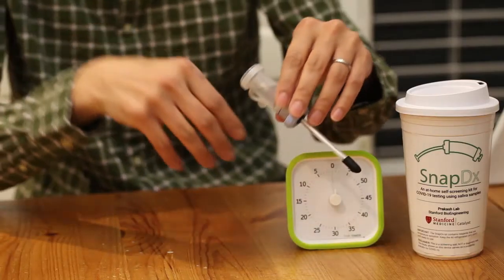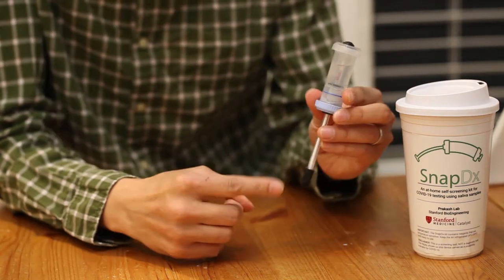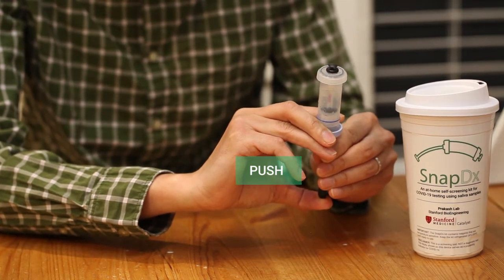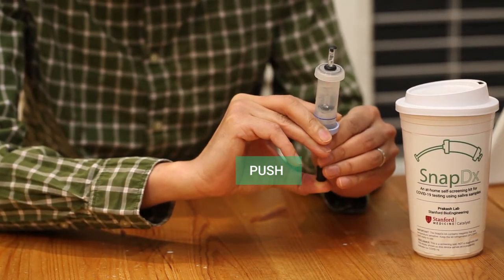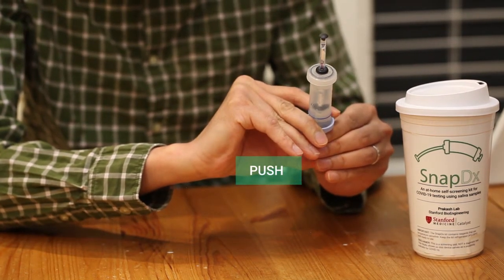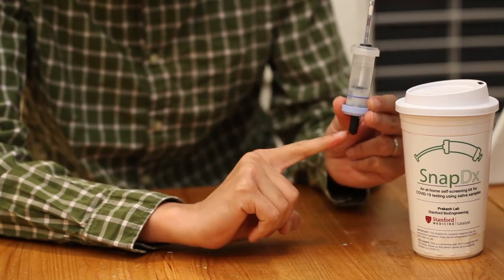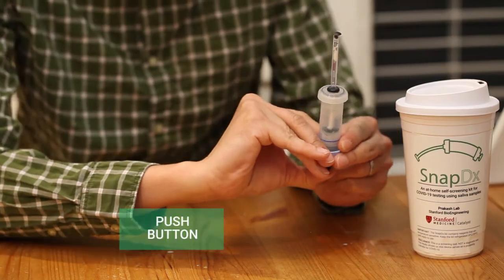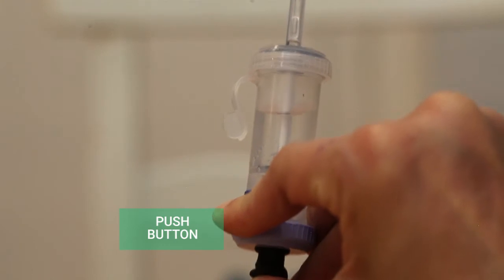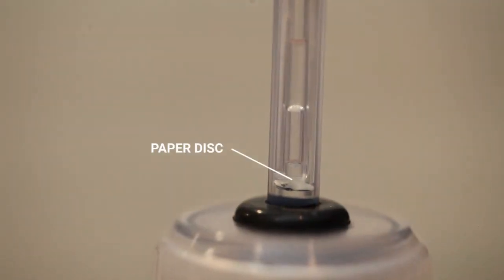Step 4. Once the tube has been resting for 1 minute, hold the SnapDx tube and use the button to carefully push the plunger up through the tube until the button reaches the blue cap. Then, while still holding the tube, use your thumb to push hard on the button until it is slightly indented. Keep pushing until a small paper disc is visible inside the plunger, just above the clear cap.